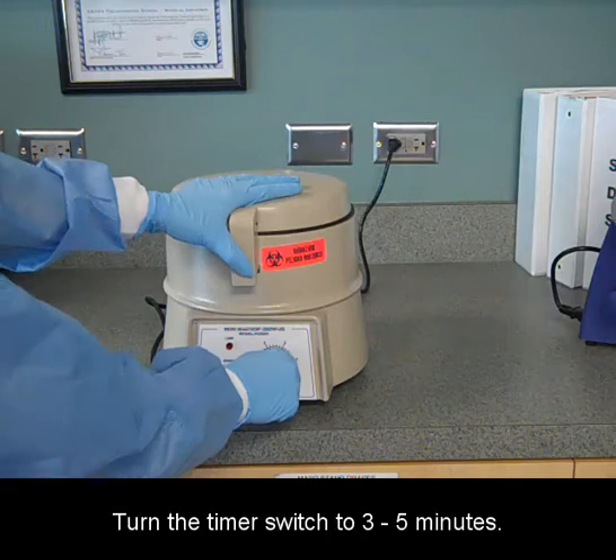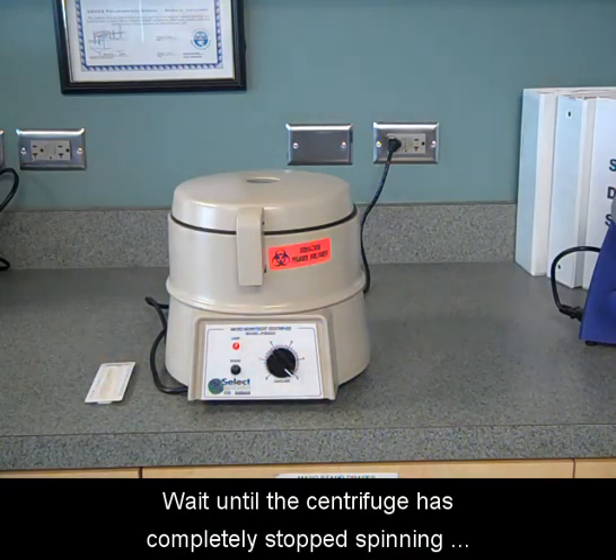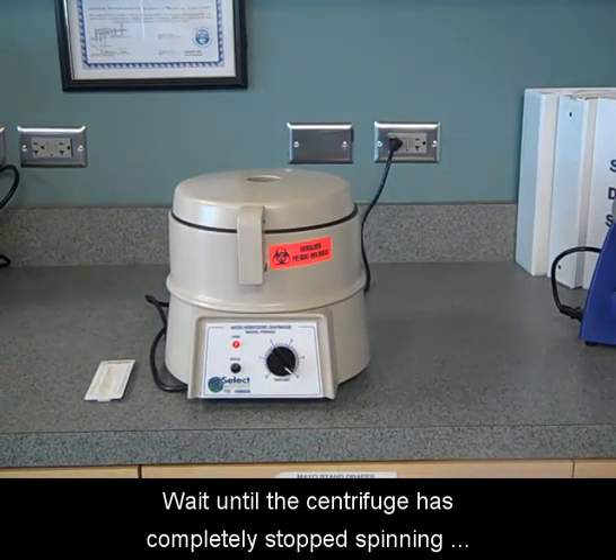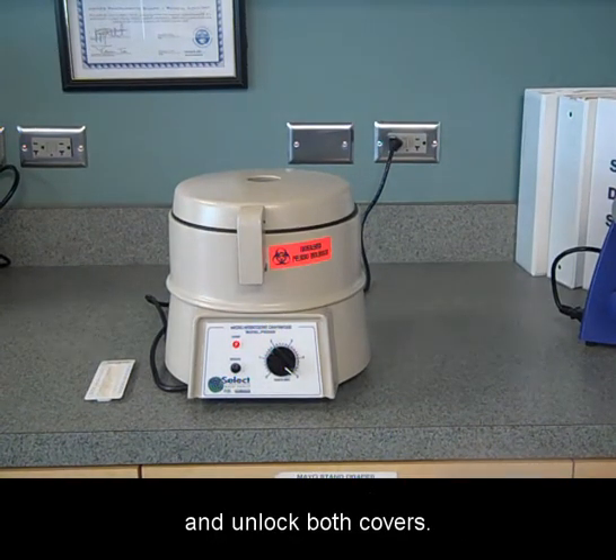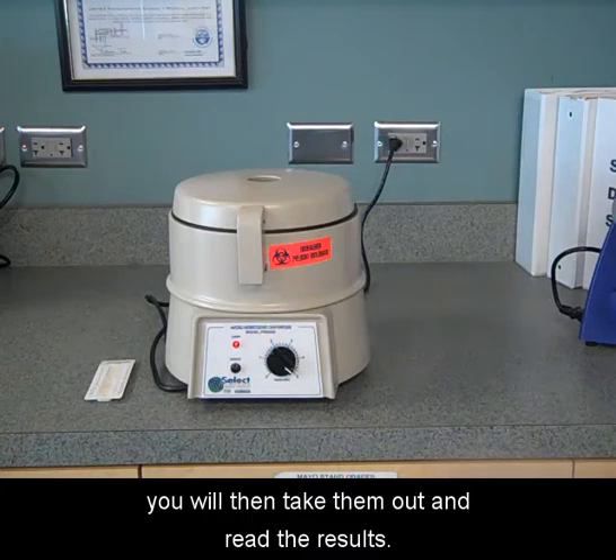Turn the timer switch to 3 to 5 minutes. It will automatically turn off. Wait until the centrifuge has completely stopped spinning and unlock both covers. When your samples are done, you will then take them out and read the results.